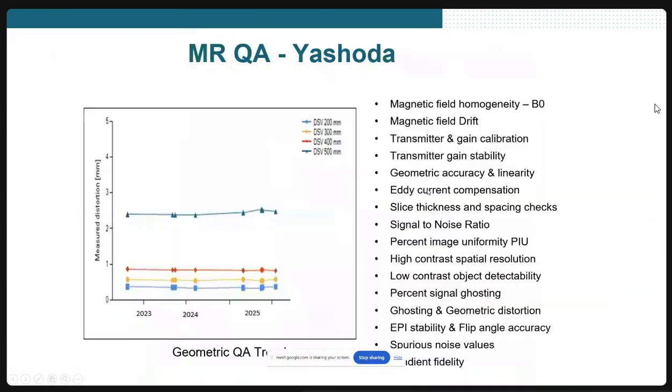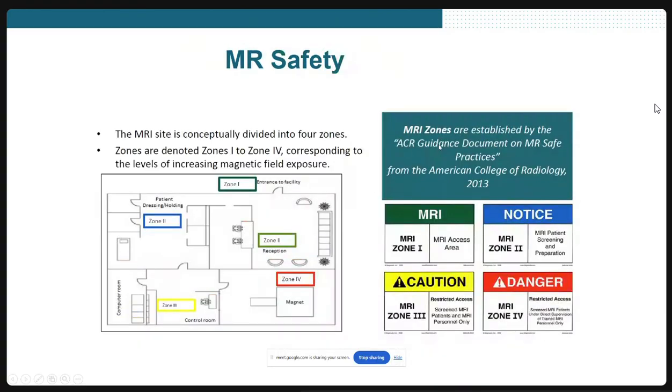So we can really believe the system and use it, and you have quite a good amount of dosimetry to be checked. Another thing is that apart from radiation safety, MR safety also plays a major role. You have to have proper MRI safety, because you cannot just walk into an MR LINAC treatment room without proper checking. There is always a possibility that you can spoil a 100 crore machine just like that by bringing a metallic item into it. So you have to be very careful. So we create zone 1, zone 2, zone 3, zone 4. Zone 1 is simple now, anybody can be there.